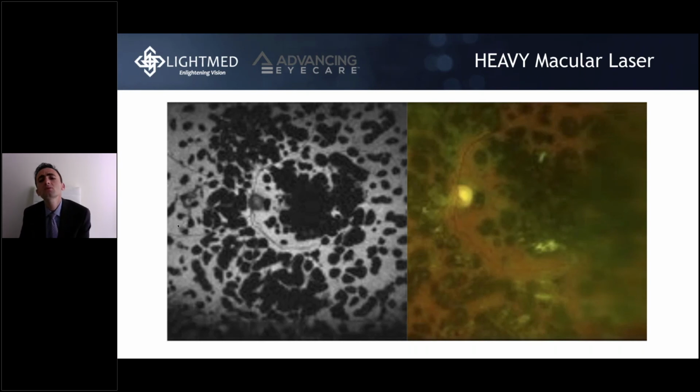I actually have a lot of patients where sometimes I do both treatments, like one session I do laser and then the other session I do intravitreal injection. And then on some of the treatment sessions, I ask them, which treatment do you prefer? And actually a good percent of my patients prefer the laser, because just the idea of not putting a needle in their eye sounds more comforting for them. The laser treatment is very comfortable. You just have to put some numbing on the eye, put a contact lens, and do the treatment sessions. And when you have the pattern scan, you apply the treatment pretty fast, so the patients are not bothered by it.